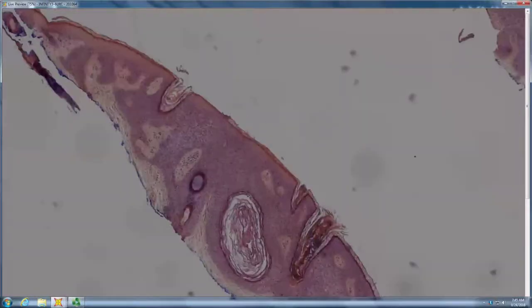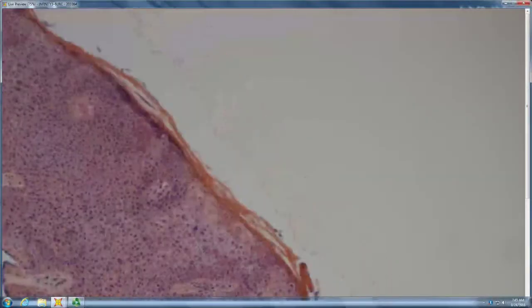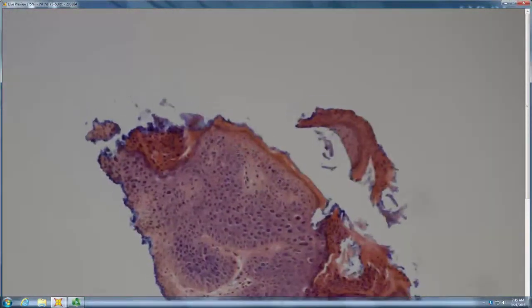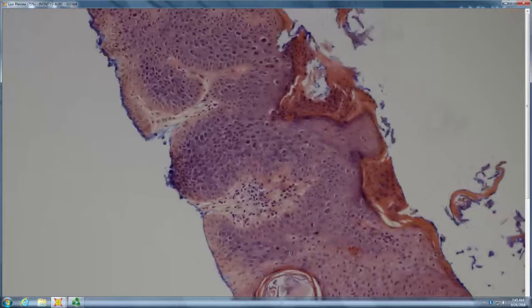So first off, what do you have here? Seborrheic keratosis. Seborrheic keratosis, and then what happened? Is this a happy seborrheic keratosis? No. What's happening in this seborrheic keratosis? Cells are kind of clearing out. Irritated. What do you think about the nucleocytoplasmic ratio? It's high. So it's Bowen's arising in a seb, which definitely happens. So, seb gone bad with Bowen's.